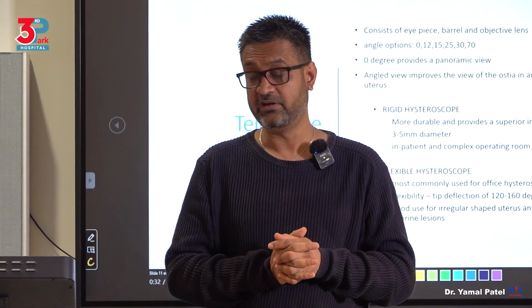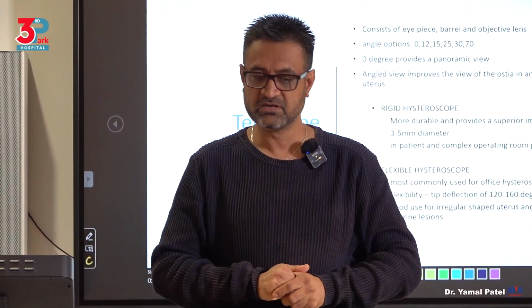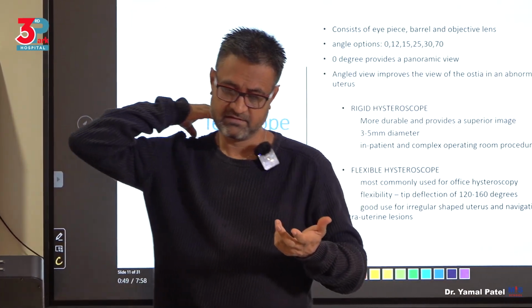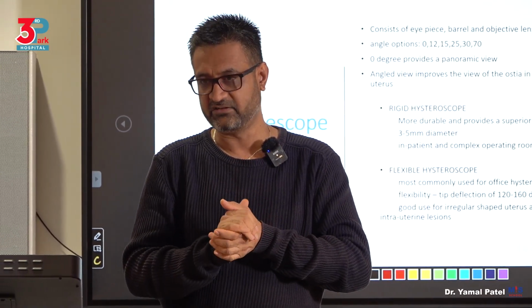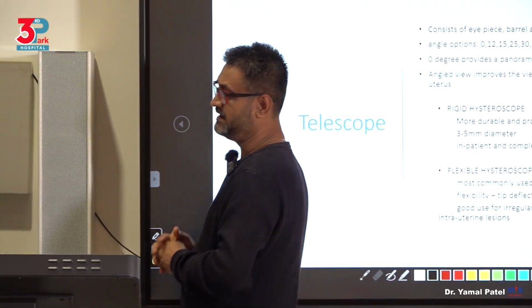So a 30 degree is very good for diagnostic because it lets you see angles that you don't normally see without moving around much. It can also be used in cold surgeries. But a 12 degree is excellent for resectoscopy, where we use energy. So please understand, 12 degree for resectoscope and energy-related procedures, whereas the 30 degree is very good for diagnostic and possibly cold surgery.